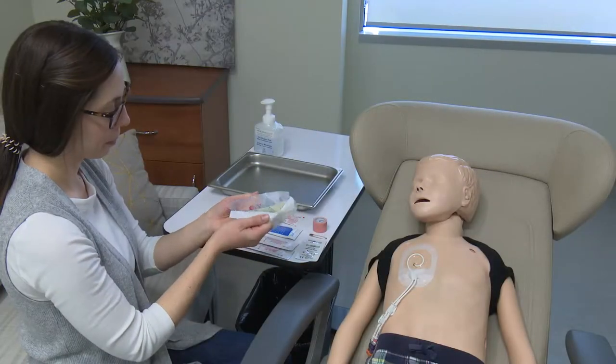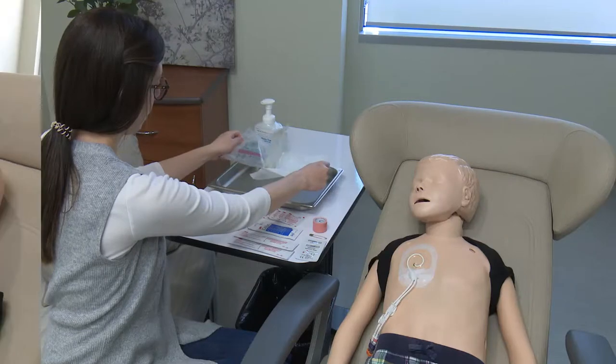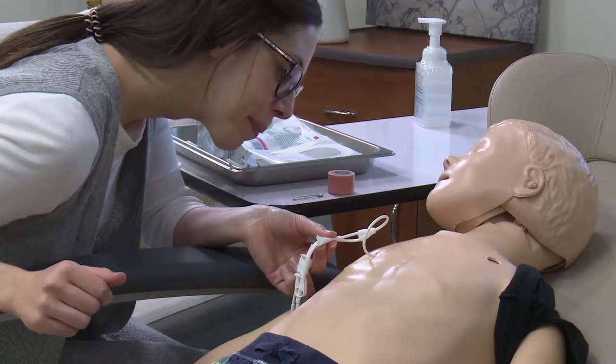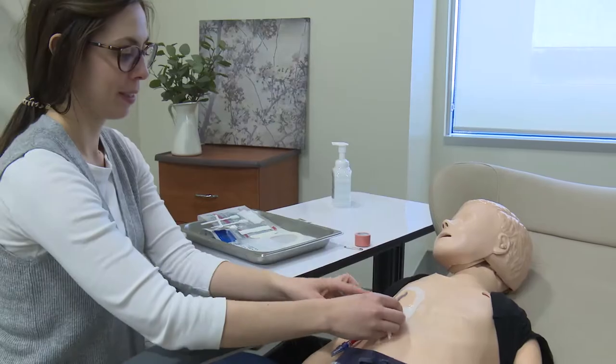Before you do any central line care, it's important to prepare and organize yourself and your child. For some children who cannot be still during their central line care, it's important that you get help from another care provider to help hold or distract your child.